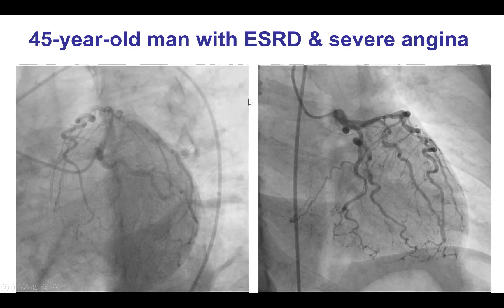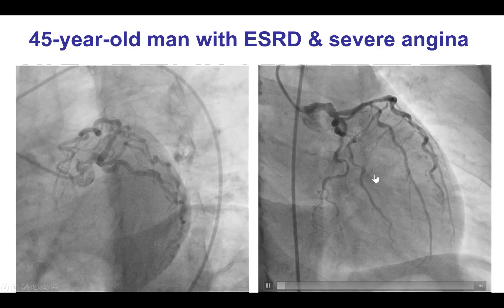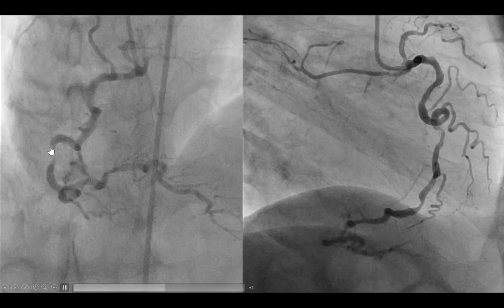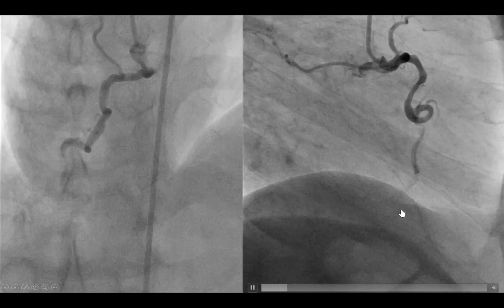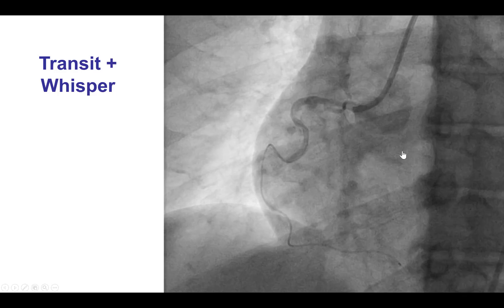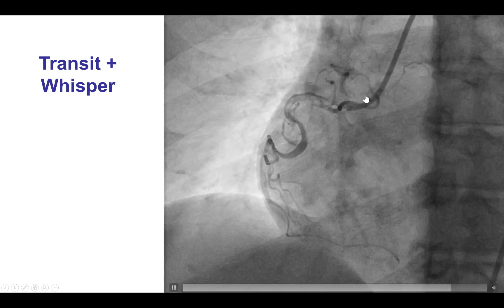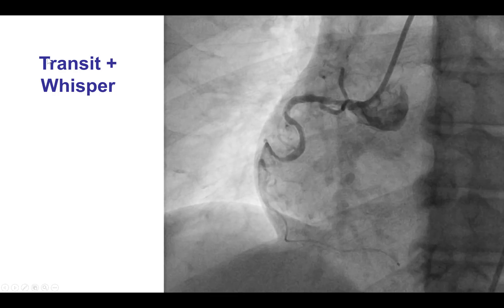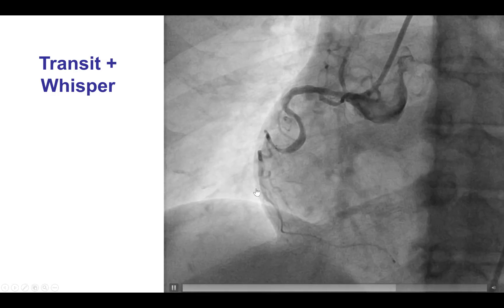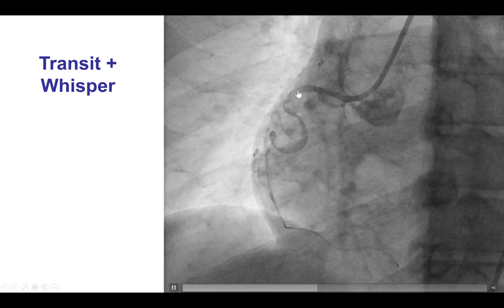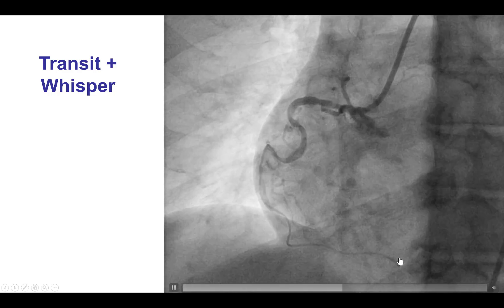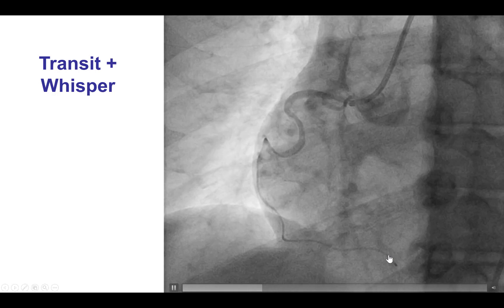This is an example of a patient with significant tortuosity on the left coronary system who also had a fairly tortuous right coronary artery with multiple lesions in the mid-segment. To wire through this, although it appeared very challenging, it was successful using a microcatheter — a Transit in this case — as well as a Whisper wire. Using this combination, we were able to wire all the way down to the right posterior descending artery.